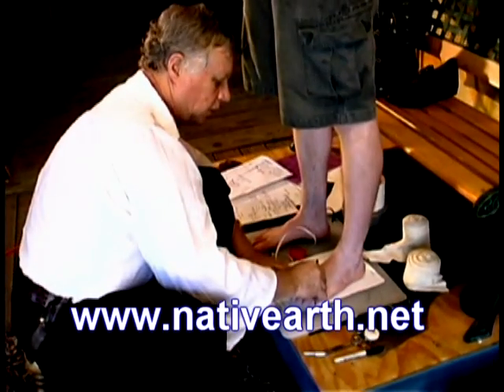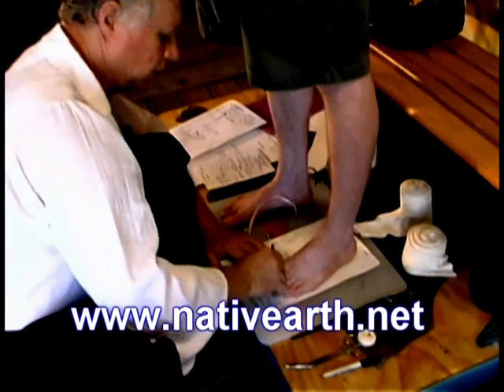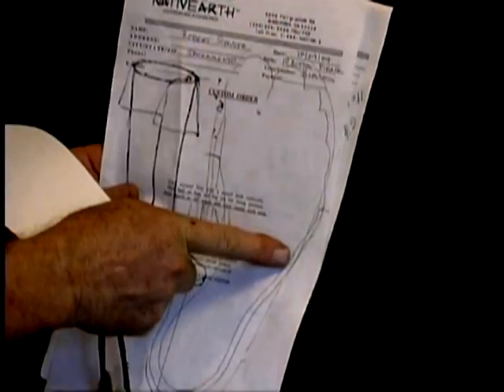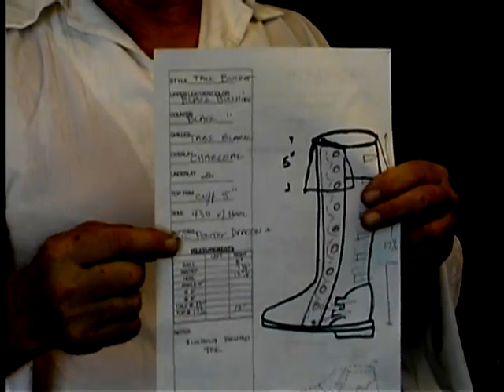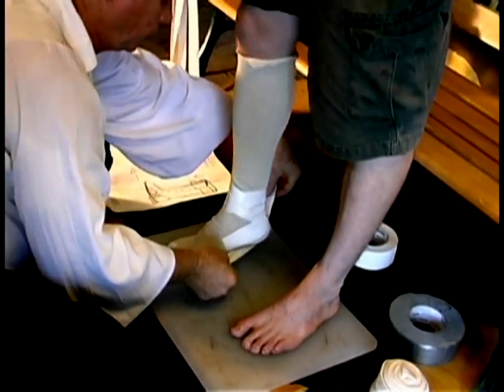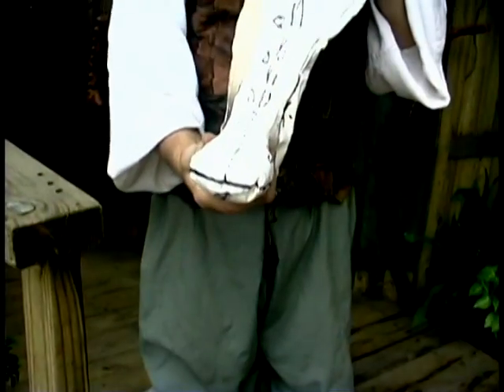Construction. We start with a foot tracing — we trace the individual's foot, left and right, and measure at four to five points on the lower foot and four to five points on the upper foot. Then we develop the drawing, take a surgical sock, put it on the foot, and tape cast the foot so that we end up with a pattern.